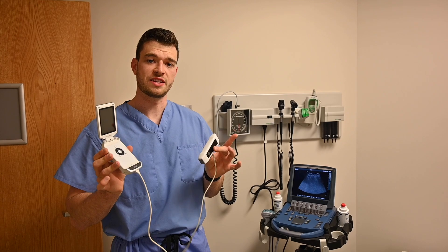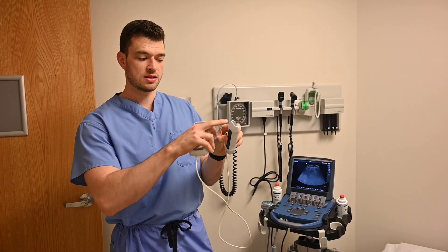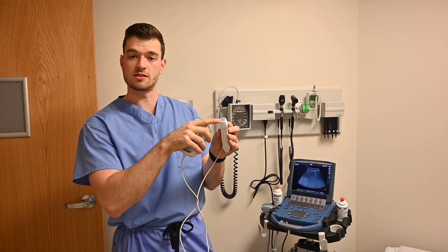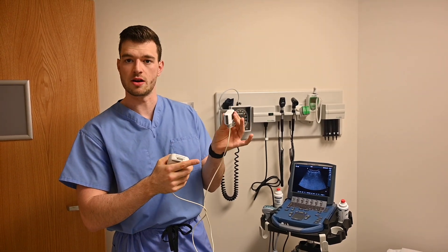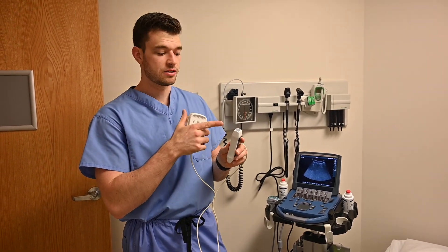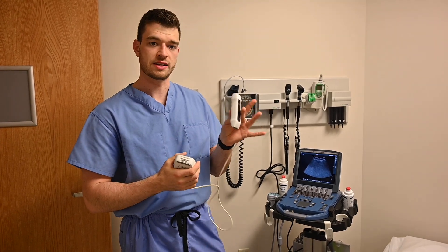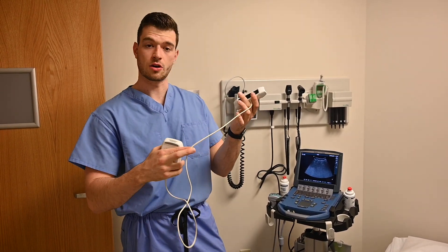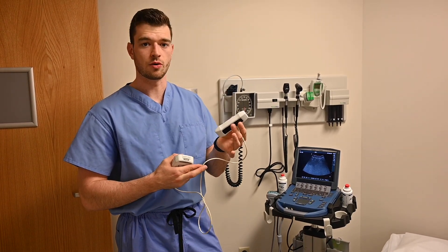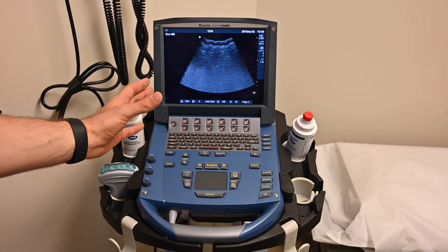Here I have a small device called a V-scan — there are multiple variations of this; Butterfly is another company that plugs right into your iPhone. It's small enough to fit in your pocket. It's a joint probe: there's a small linear probe, good for surface structures, and a phased array, which is great for cardiac. There's no curvilinear here, so you'd have to use a combination of the two for your FAST exam. Inside the probe is a crystal that generates the sound wave, so these are very delicate. Be careful of the cords and the transducer — never let it drop or hit the floor.